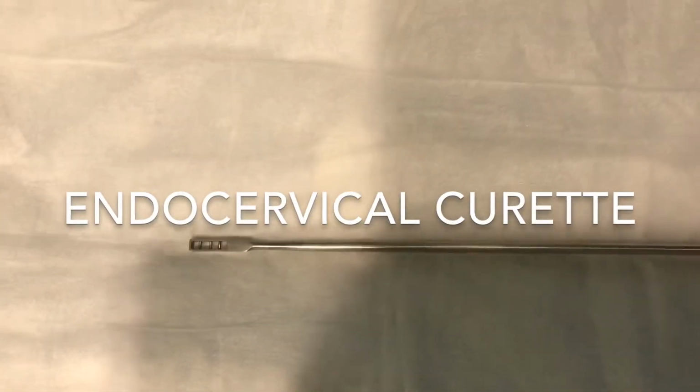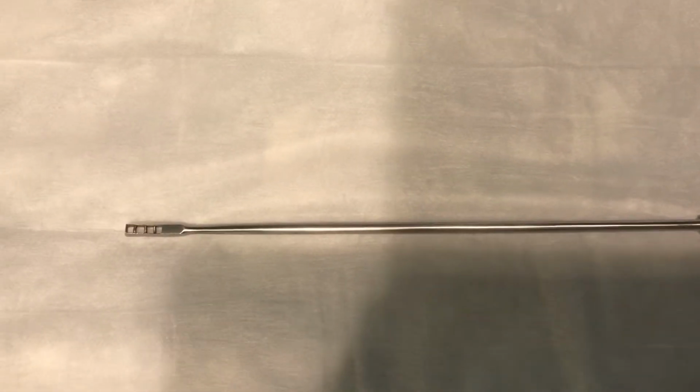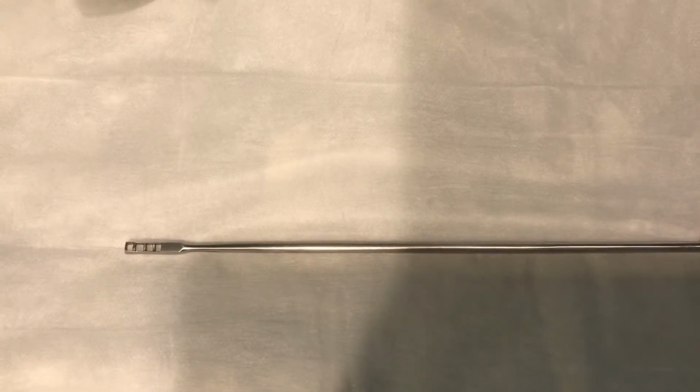Abnormal cells start here at the end of the cervix, which is where it's exposed to the HPV virus, but then abnormal cells can also grow up this way on what is called the endocervix. To reach up into the endocervix, we use something called an endocervical curette. When we use this, we go back and forth in the endocervix, and that is often the most severe cramping of the entire procedure. After that, there is often some bleeding.